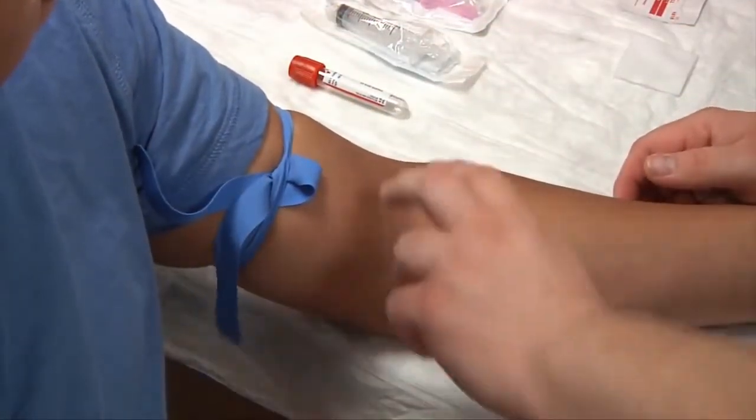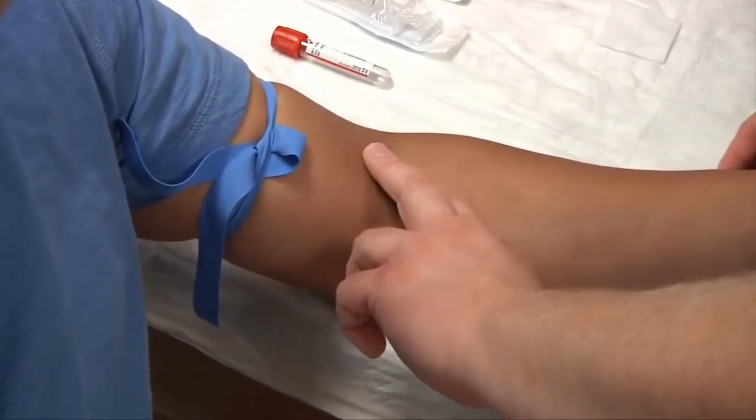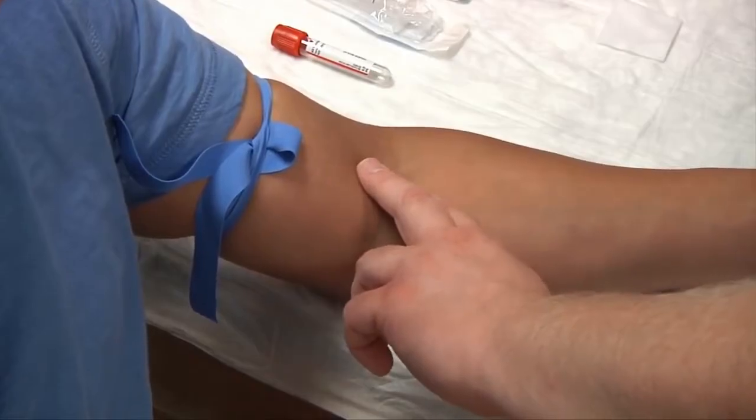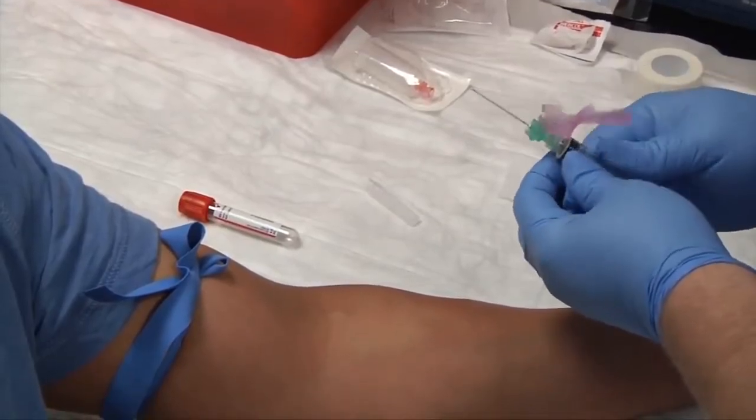So we're going to palpate with our two index fingers of our non-dominant hand. Maybe we need to ask our patients sometimes to make a fist. Check our needle, make sure everything's okay with it.